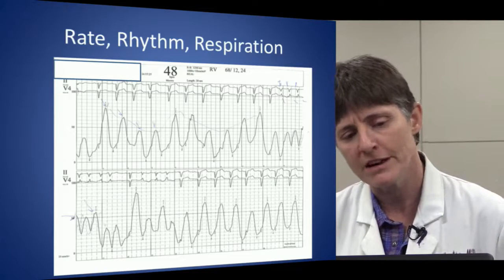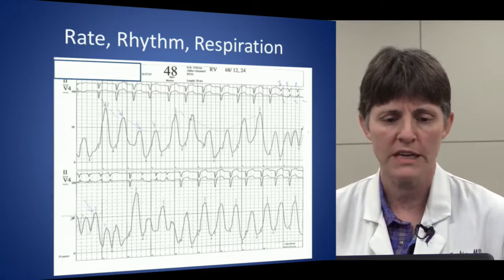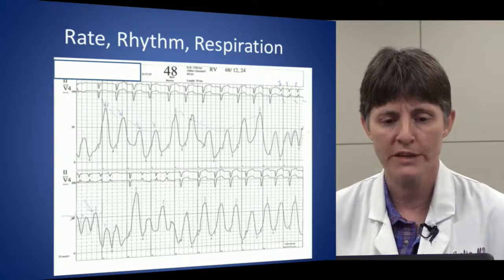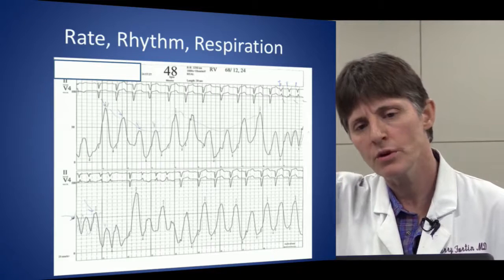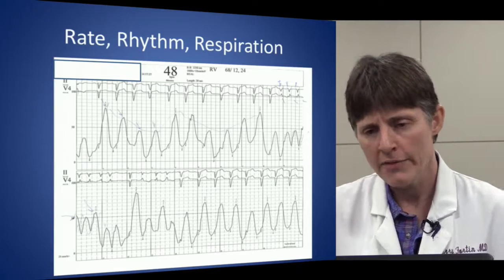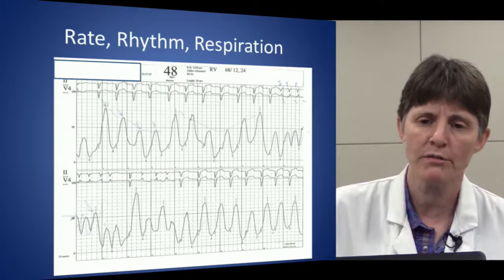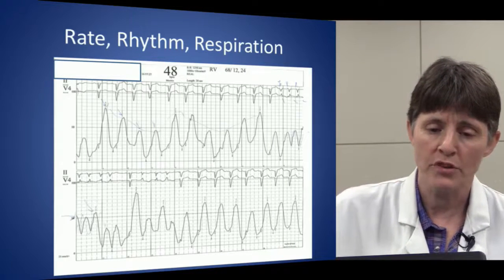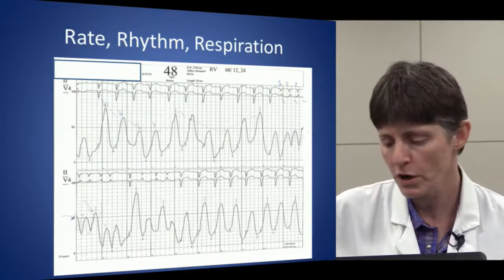When you see that fast, narrow complex, the overall pressure is lower. When there's a pause in the EKG, you then see lots more filling time, and then you see a high pressure. So there's some respiratory variation going on, and then there's a difference between peaks and valleys because of the rate of the EKG. So if somebody's very, very tachycardic, they may have very much lower pressures because of this.